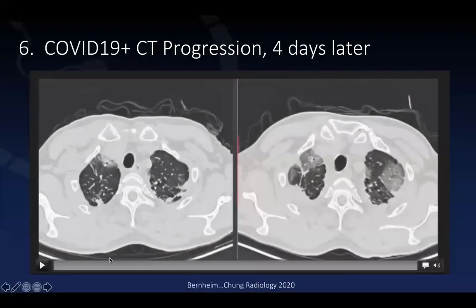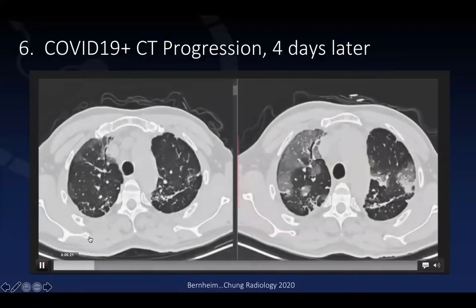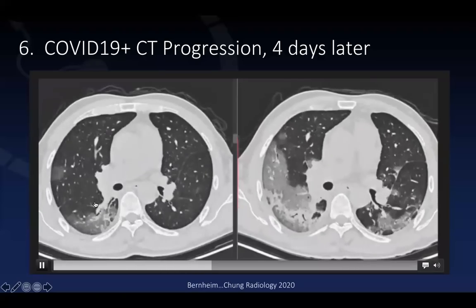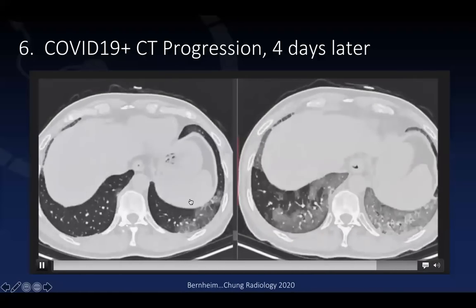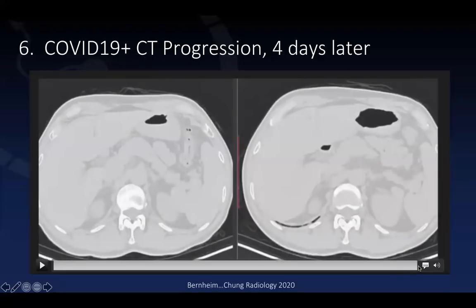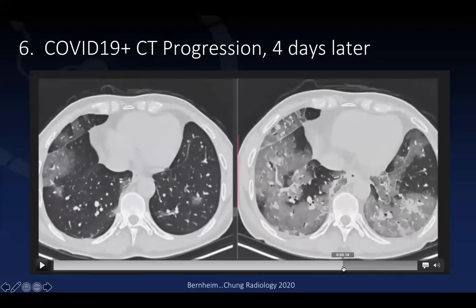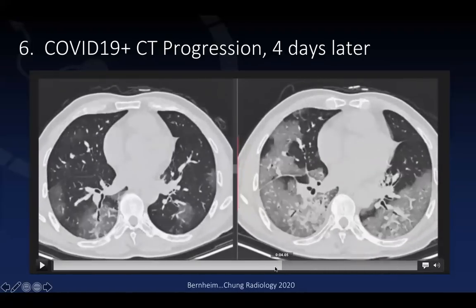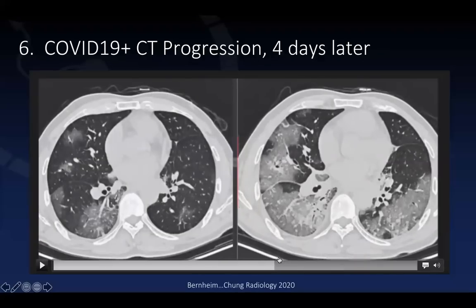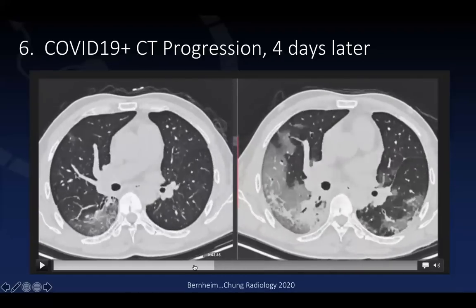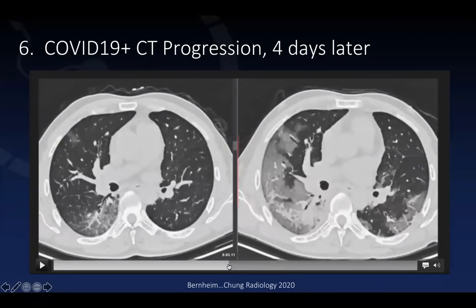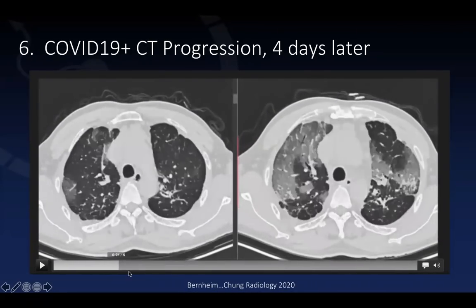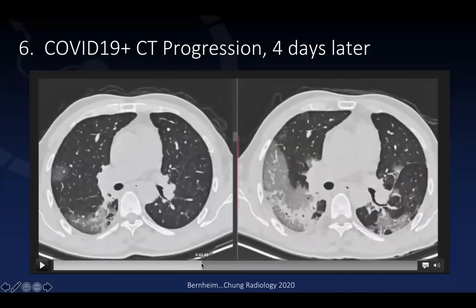Here's another patient where the lung apices show changes of chronic granulomatous disease. Four days from the initial CT, one can see an increase in the extent of extensive ground glass and areas of emerging consolidation — evolving, increasing findings of pulmonary opacification in a very basilar-predominant and peripheral pattern of patchy pulmonary opacification.